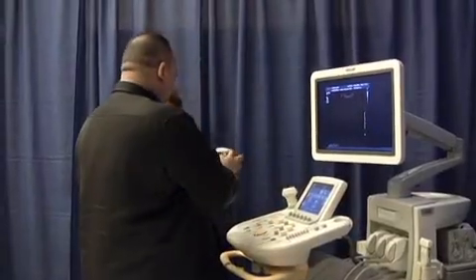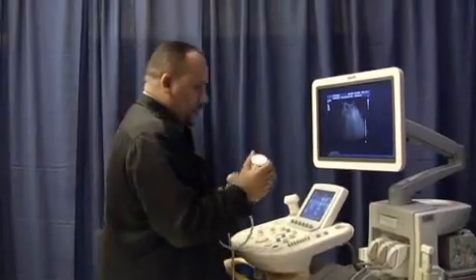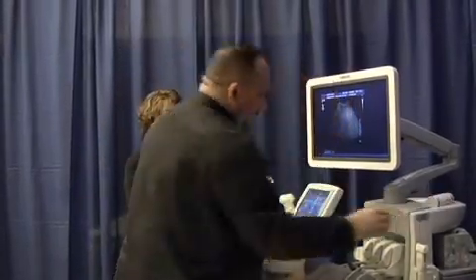So I got some help from Terry here. Thank you, Terry. Liberal gel is always a good idea.